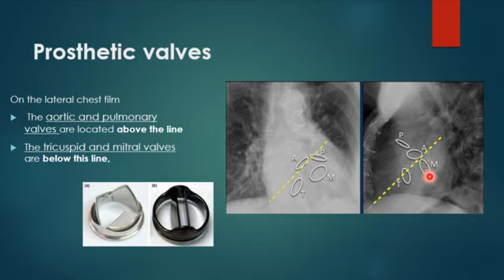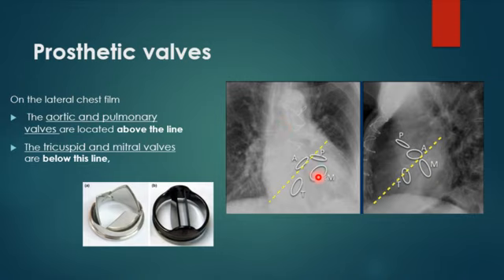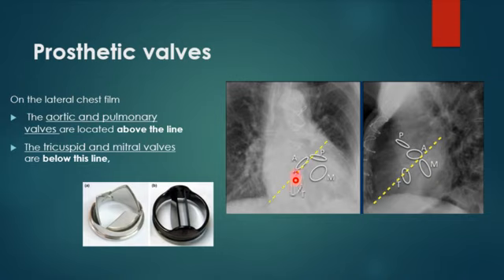On the PA view, draw a line from the left atrial appendage toward the right cardiophrenic recess. The valve above this line is the aortic, with its orifice directed toward the ascending aorta. The valve below is the mitral, with its orifice directed toward the apex. The tricuspid is variable but usually more to the right side, more inferior, and often overlaid by the vertebral bodies. The pulmonary is the most superior and most superficial.